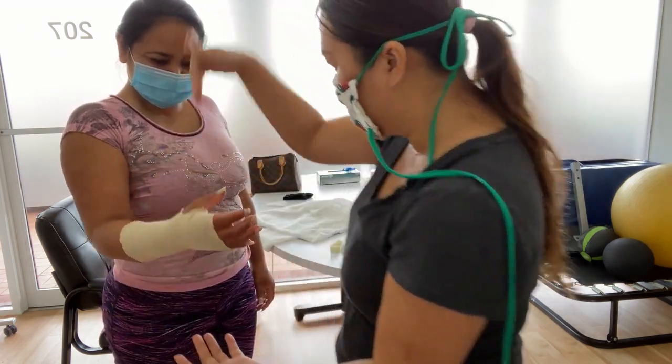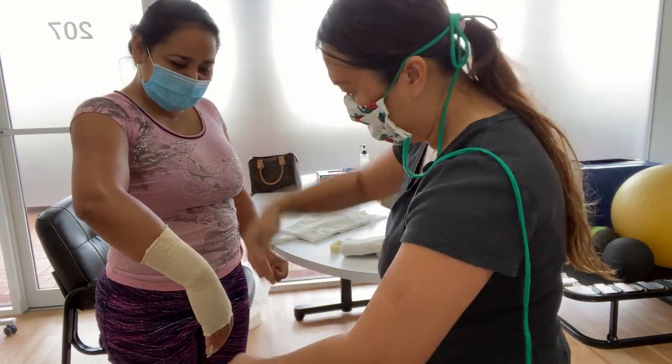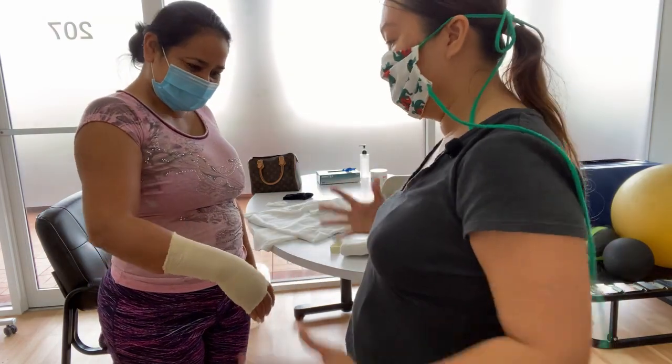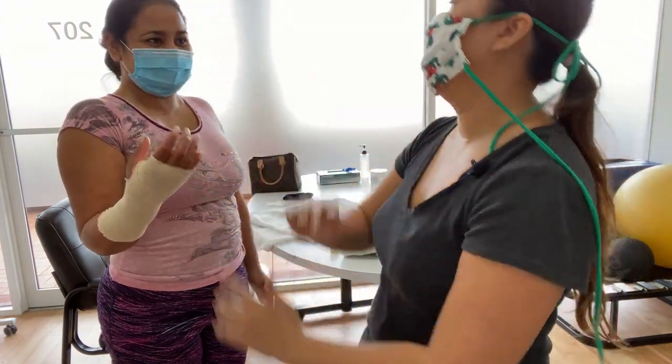So you use gravity to help you. He holds it open, and then you slide it in. Boom, done. If you're going up against gravity, it makes it hard.